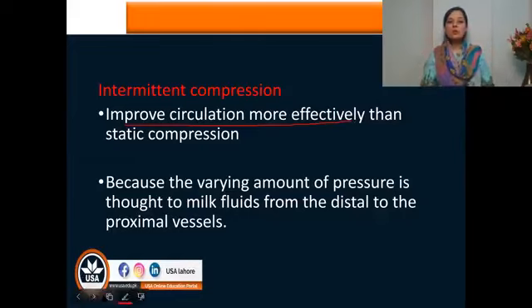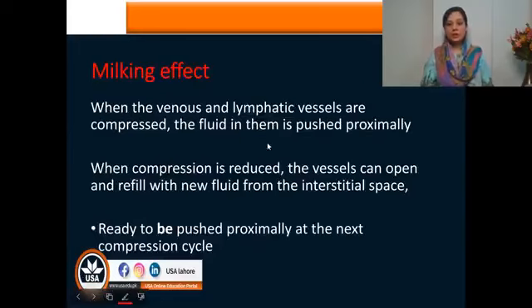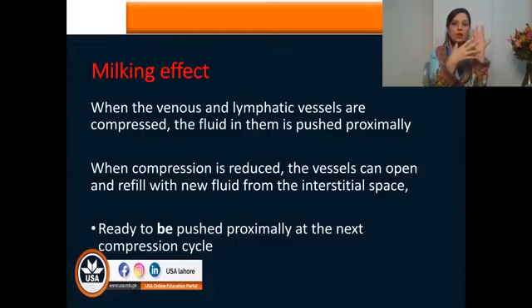So moving towards the next important thing, in short, the intermittent compression is going to give you a milking type of effect. When you apply pressure, you exert a pumping action. When you relax, you allow the vessel to refill. So this is said to be the milking action.